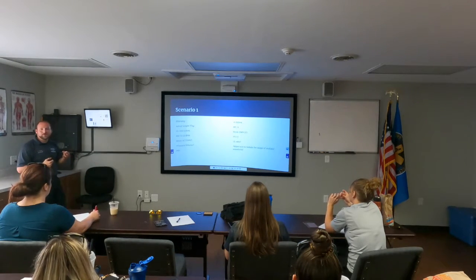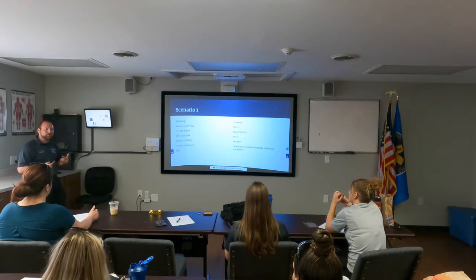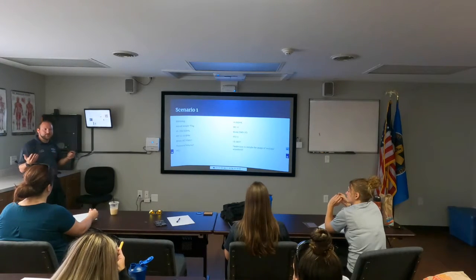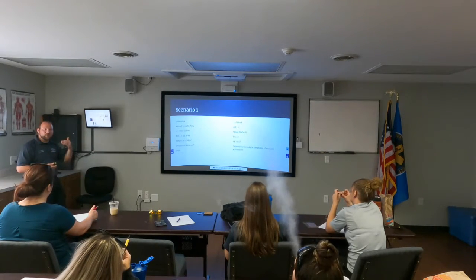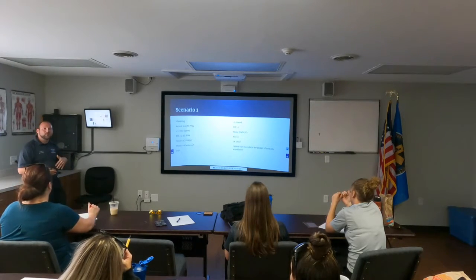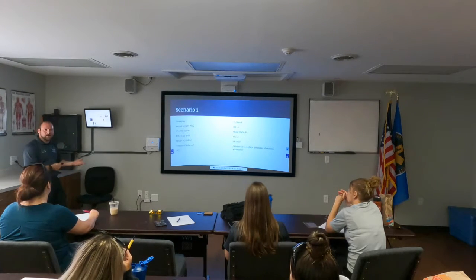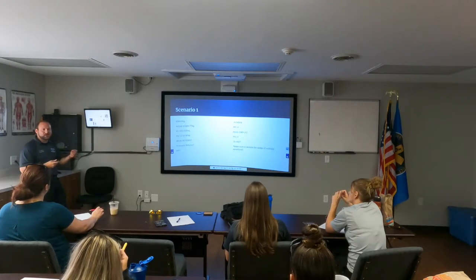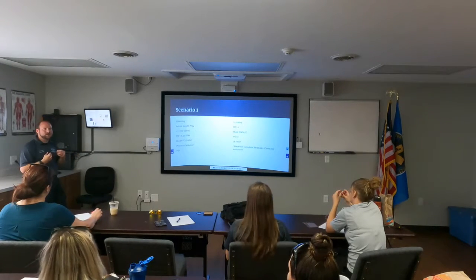Okay. The next 3 scenarios are all going to be purely on BiPAP. After we do that, we'll take a real quick little break, and then I've got 2 vents. We'll split into groups of 10, and basically we're just going to go over each mode, the different alarms for each one, and how we set that up. We will also go ahead and initiate BiPAP on me, just so you guys know how it's set up, what it should look like, and some problems that we'll run into for someone who has a spontaneous respiratory drive, and some of the alarms that we run into that make us second guess what we're doing.